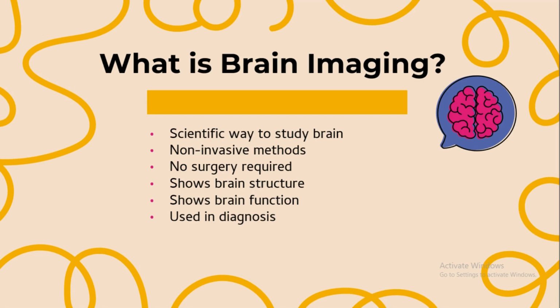What is brain imaging? It is a scientific way to study the brain using non-invasive methods. No surgery is required. It shows the brain structure, shows the brain function, and is used in diagnosis.